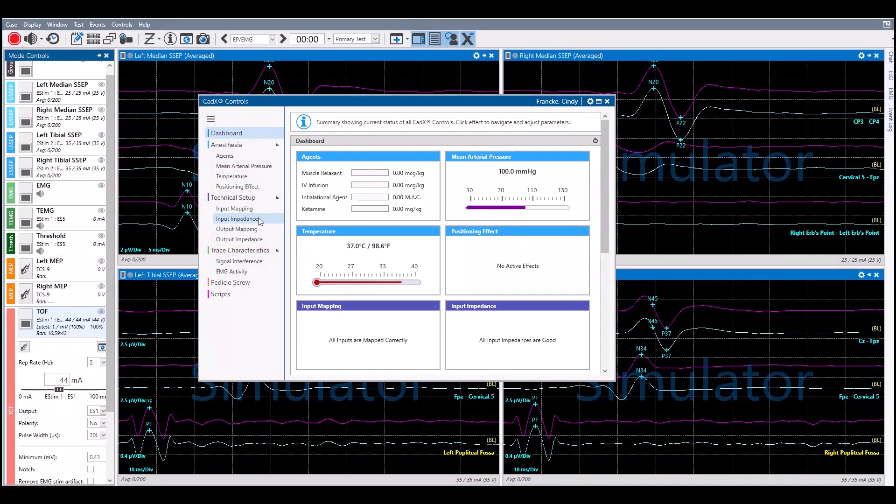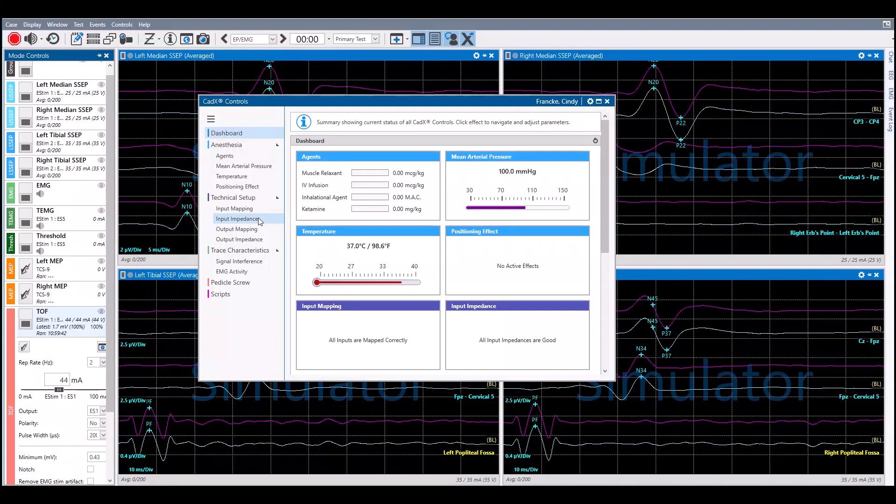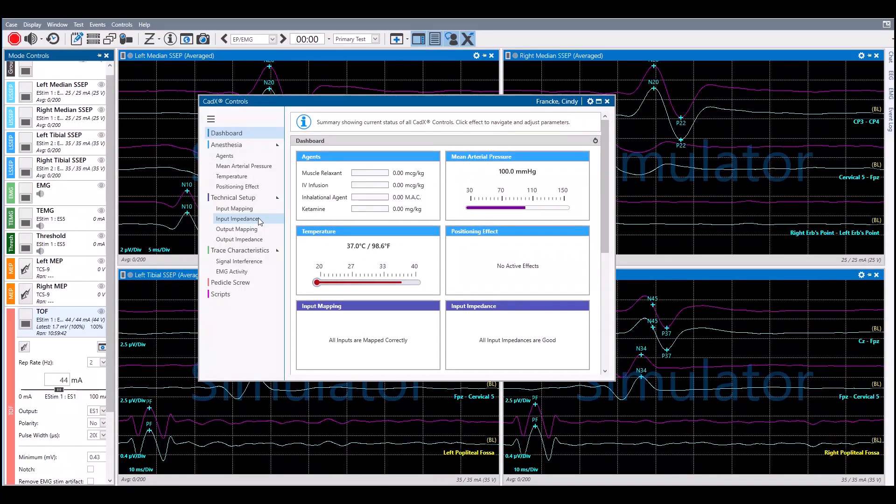Click on either the input impedance for the recording electrodes or output impedance for the stimulating electrodes. To make changes for recording electrode impedances, click on Input Impedance.